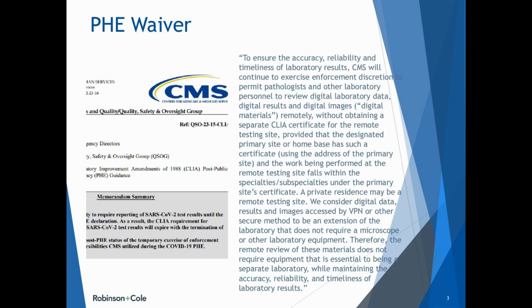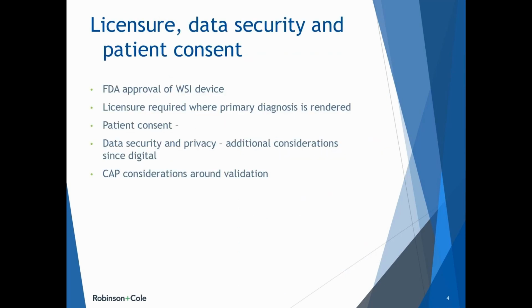Regulations often lag behind the rise of technology, and so we can expect to see more in the future. Some other things you have to think about from a regulatory perspective: because we now have this kind of digital nomad telehealth situation for pathologists, where they may be all over the country and reading the professional component digitally.